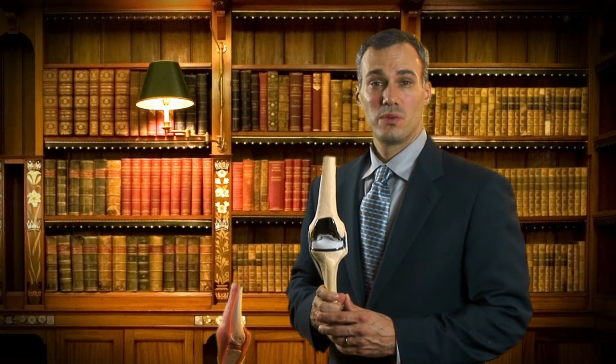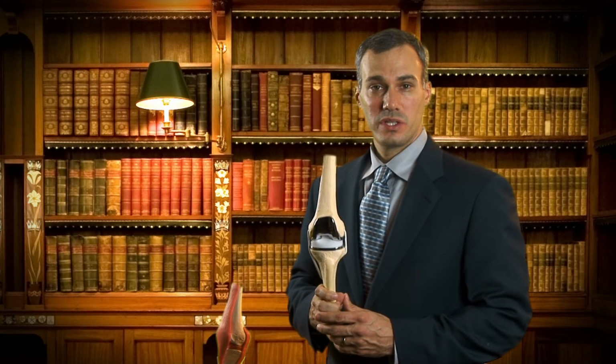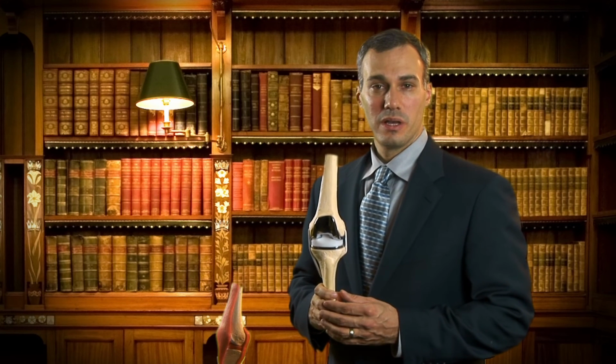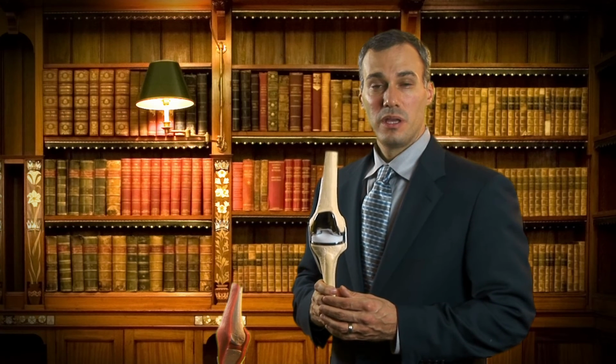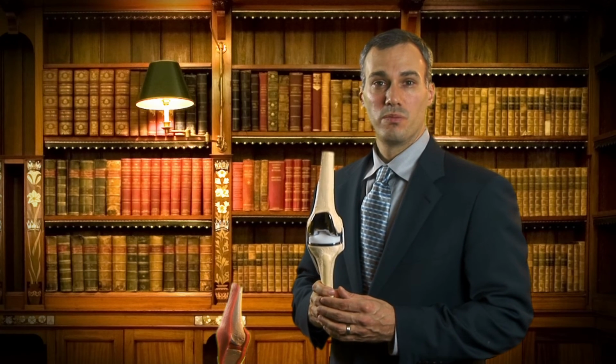Lastly, your surgeon will turn his attention to the kneecap. If he decides to resurface the kneecap, then a small sliver of bone will be removed and then a new polyethylene component will be cemented into place. The surgeon may then place a deep drain. He or she will close the soft tissues, apply dressings, and you'll be brought to the recovery room.